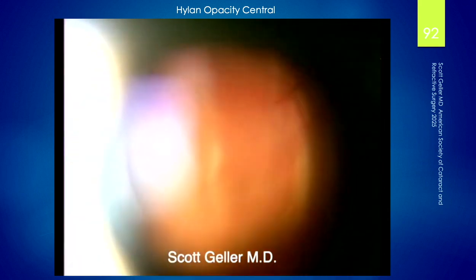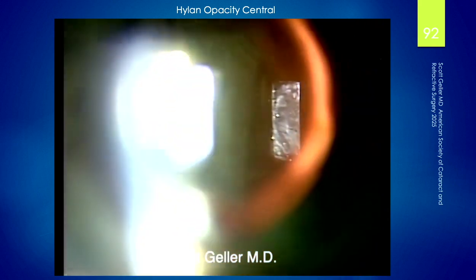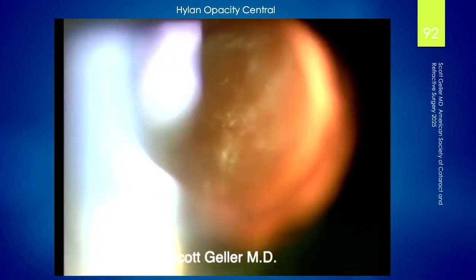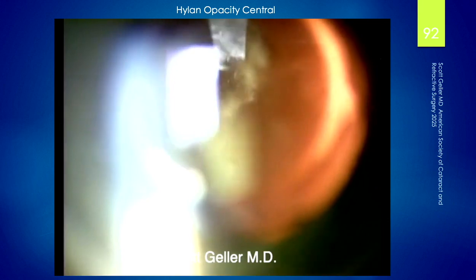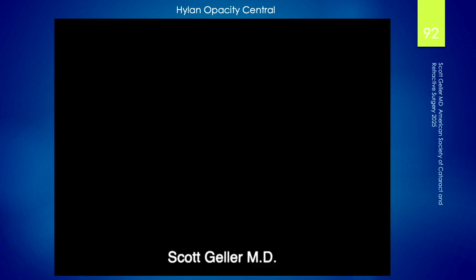The end result is we finally did get it out of the visual axis. This definitely took two or three times, if I recall correctly. And this little haze there, that's not bothering the patient too much. Fascinating case, if I don't say so myself.